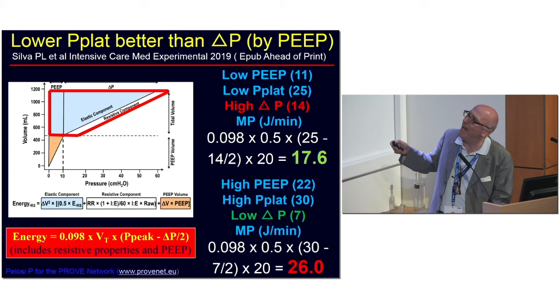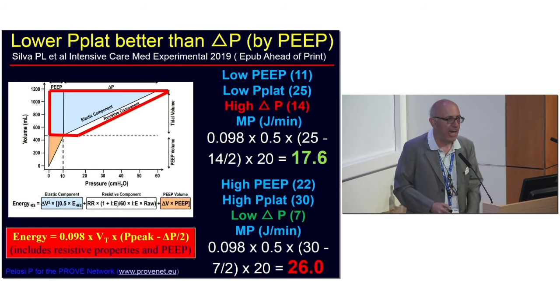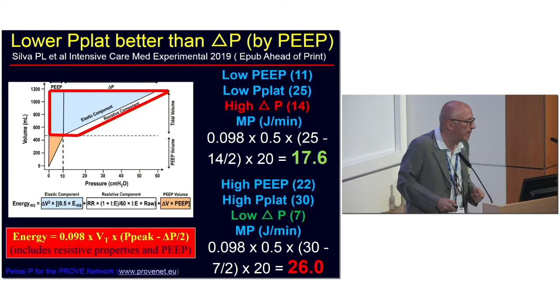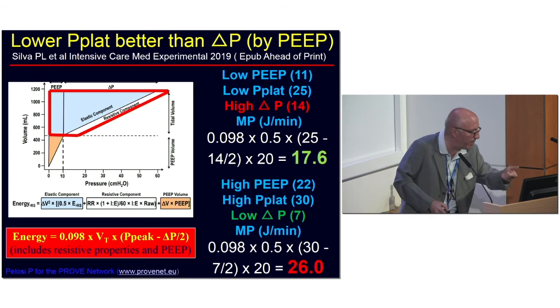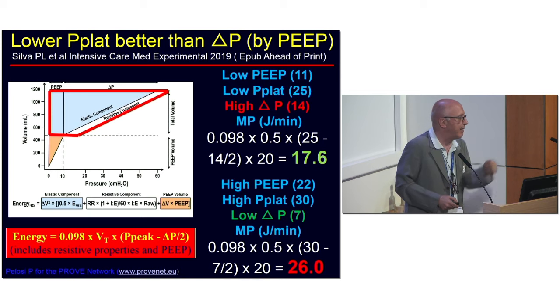And we increase not too much the plateau pressure, within the limit at 30, and we markedly decrease the driving pressure, and we are happy. That's correct? We are happy because we put the PEEP high and driving pressure decreased. Compliance improved, so the patient is better.